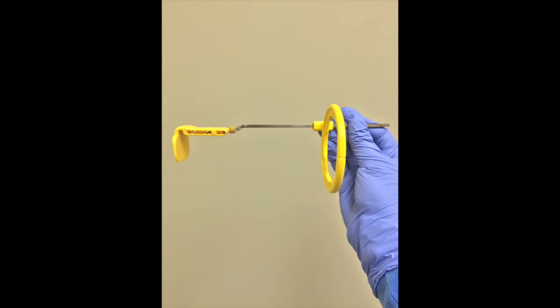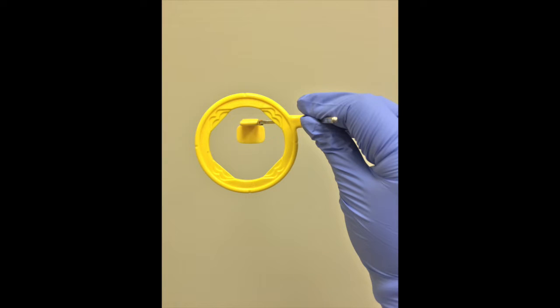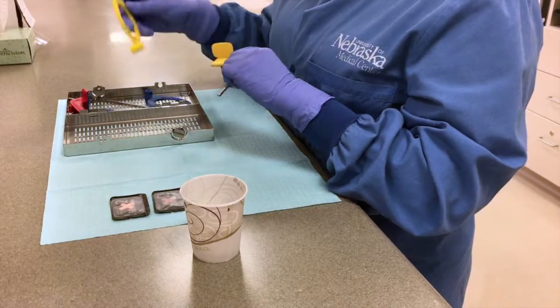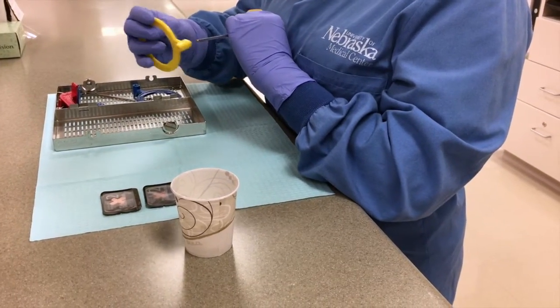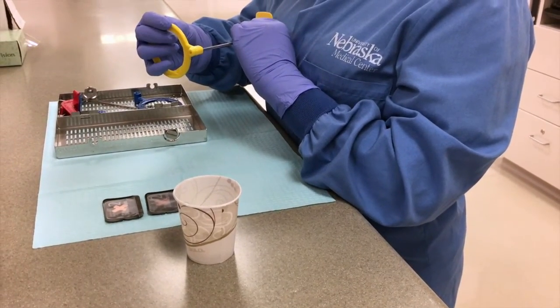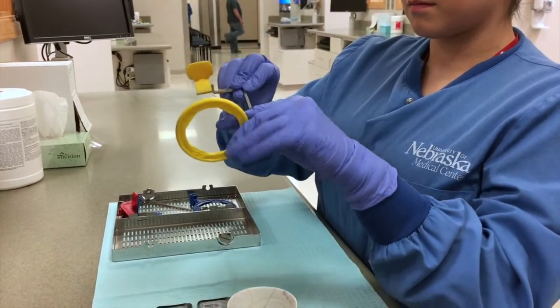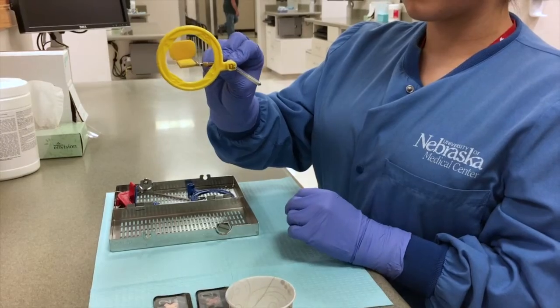You want the ring to be centered with the bite block. The clinician will first demonstrate the incorrect way to put the ring together, and then show the correct way to place the ring together.